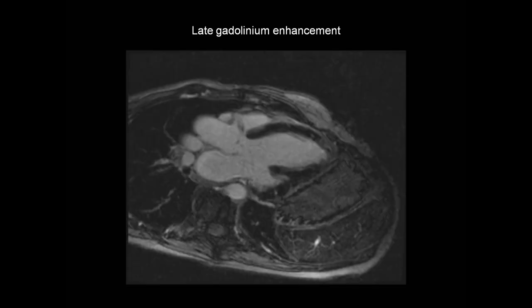Here's a different patient. This is a late gadolinium enhancement image in the three-chamber view, showing the left ventricle, left atrium, aortic valve, and aortic root. Again, most of the myocardium appears dark, but there are patchy areas of late gadolinium enhancement present in a non-ischemic distribution — it is not sub-endocardial, but rather present in the mid-wall. This meets one of the criteria for the CMR diagnosis of myocarditis.